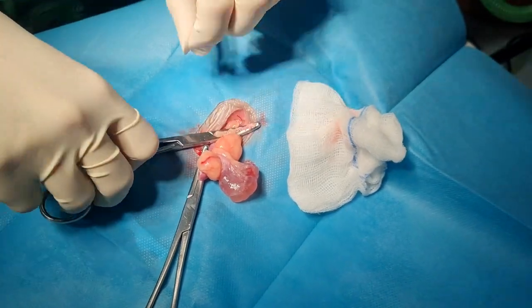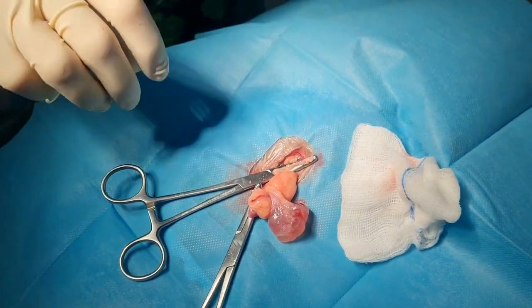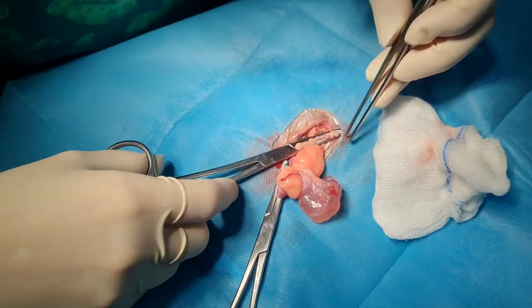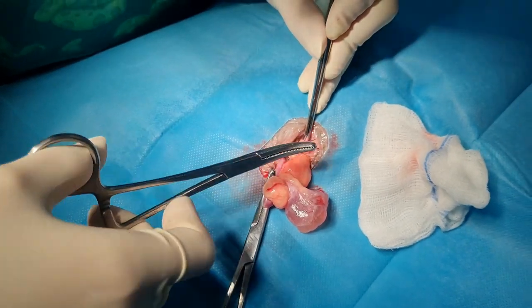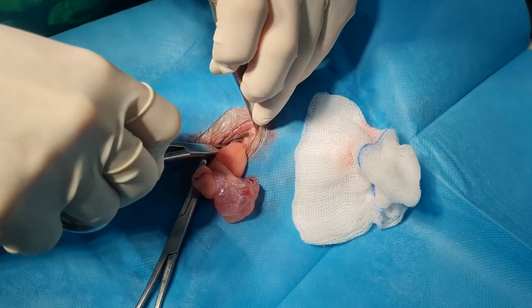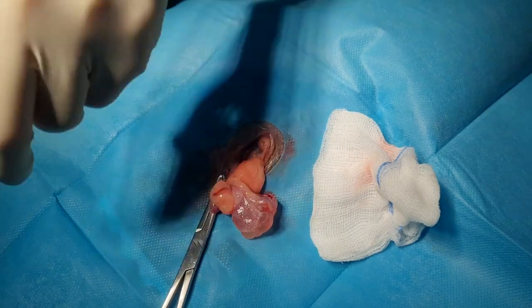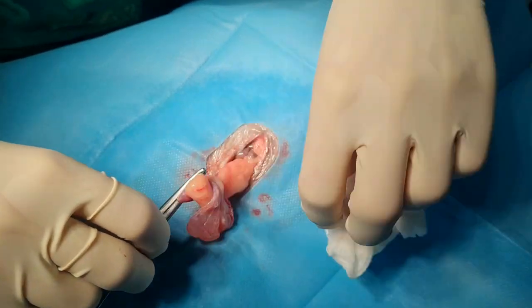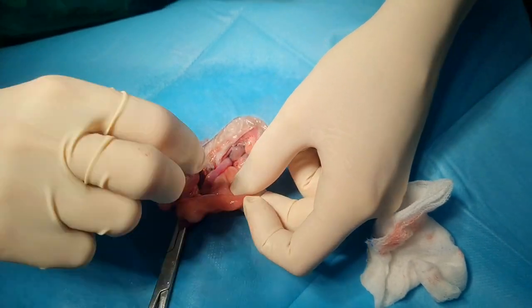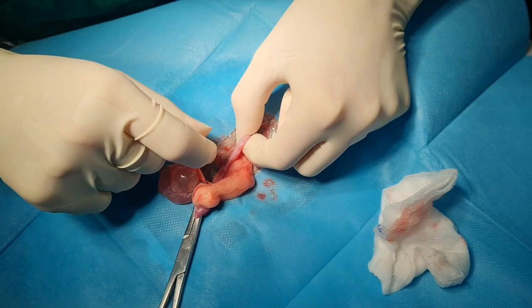For those of us that are dinosaur vets — there was a discussion recently saying don't call yourself a dinosaur vet, that makes you sound unvalued. I'm quite happy to be a dinosaur as long as I get to be a cool one. So you can go back in there, little pedicle. Follow it down — there's that typical gonad fat pad that we see on all our rodents, which I think makes our lives much easier.